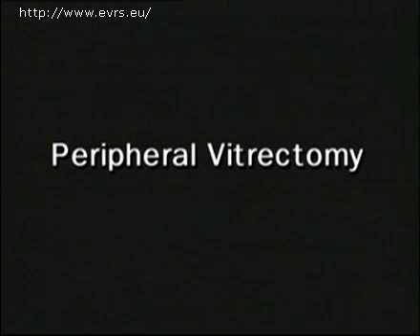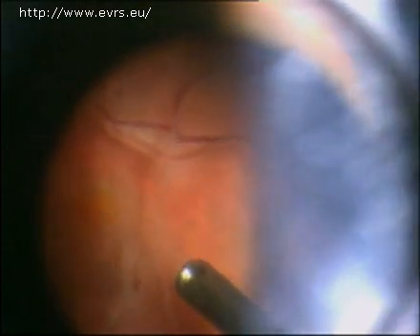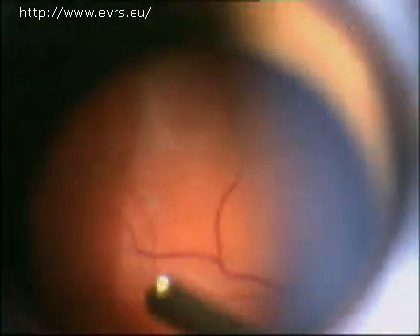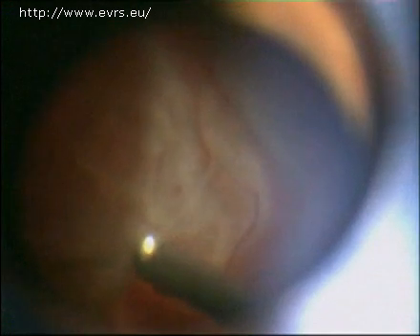For the peripheral vitrectomy, it is not so much a question of going quickly, but of being precise. Using a venturi pump with an infusion at 70 cm, one is not able to aspirate in BSS at less than 8 cc per minute. Yet at the end of the central vitrectomy, the tubing is often filled with BSS. That was the case here, where I had a first alert that made me lift my foot from the pedal. But in spite of that warning, cutting at 700 cuts per minute, in less than a third of a second, the minimum flow with this venturi pump created a disastrous problem. Seeing this again in slow motion shows us that a flow of 8 cc per minute is sufficient to cause a tear within the space of 3 cuts.